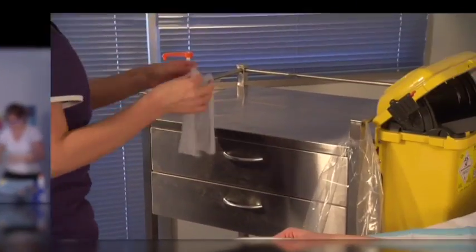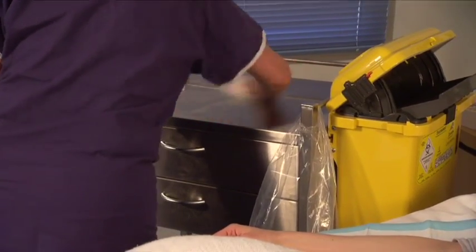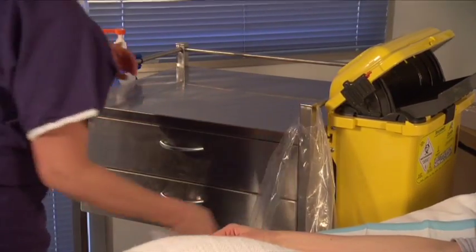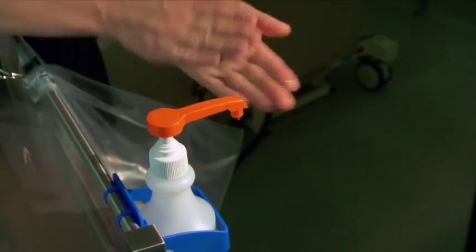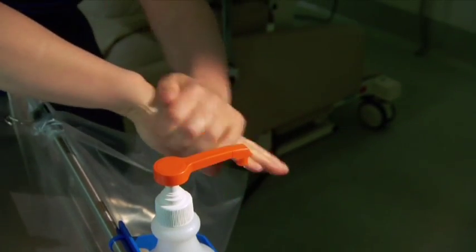The prevention of infection associated with peripheral IV cannulae requires that a number of practices be optimally performed at the time of insertion. The insertion of peripheral cannulae should be performed under aseptic conditions and using a recommended skin antiseptic. Surfaces should be cleaned down immediately prior to any procedure, even if visibly clean. Hand hygiene should be performed immediately prior to assembling procedural equipment.